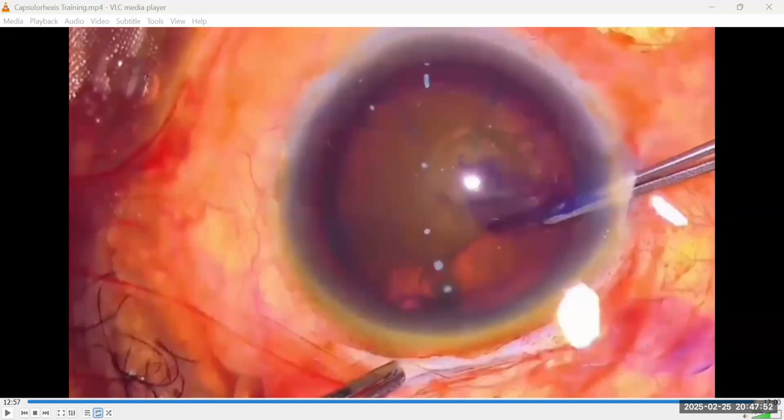And also spiral rhexis, if you misjudged your lens opacification classification, and suddenly you discover that this nucleus is denser than you had planned, instead of doing a 5mm rhexis in diameter, you can now do spiral rhexis to continue as a 6mm rhexis. So you can do a double rhexis as planned primarily, or you can do a spiral rhexis if the danger you anticipated was overrated.